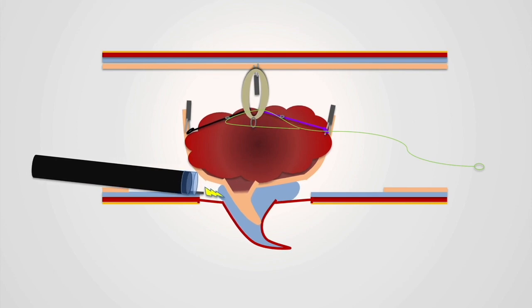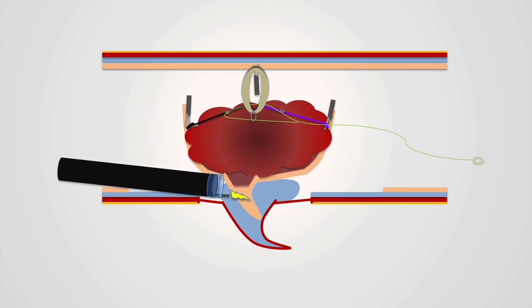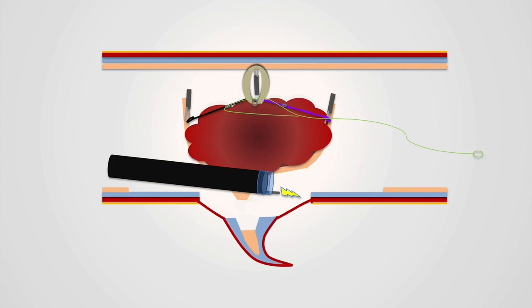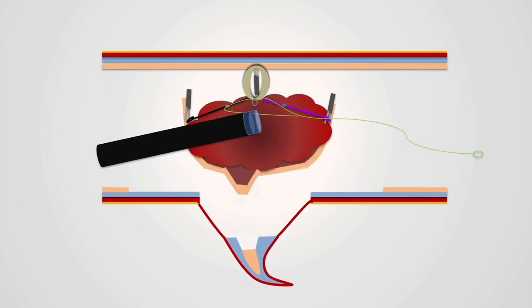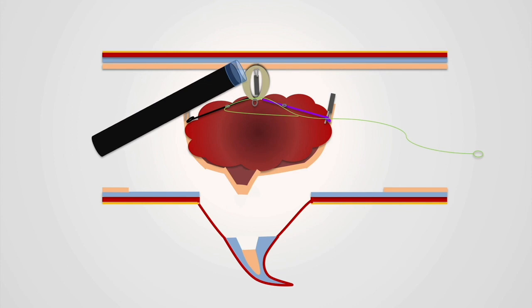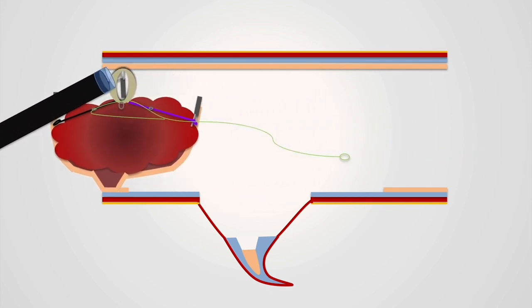It will allow us to dissect deeply. When we make the appendix free, it will open again and flare out again. Once we are at the deepest point we can reach, we will cut the mucosa from the submucosa to the lumen of the appendix, and therefore we will remove the specimen.